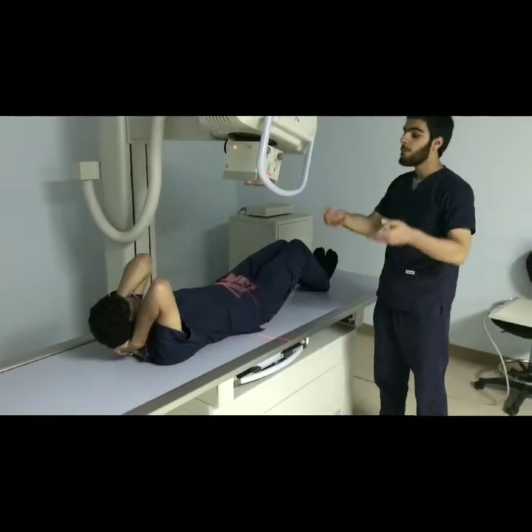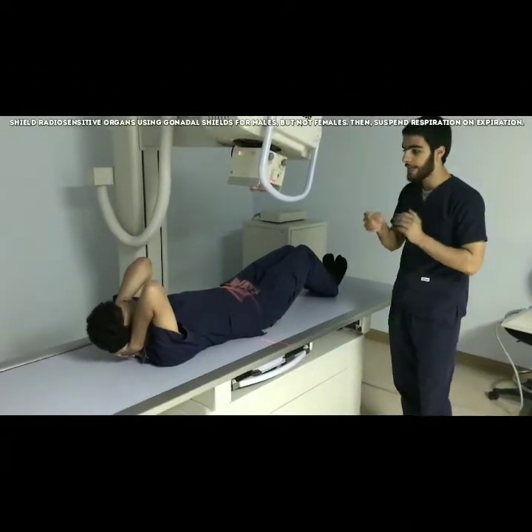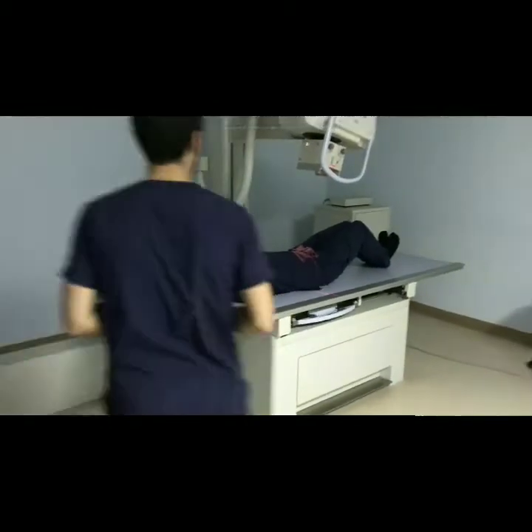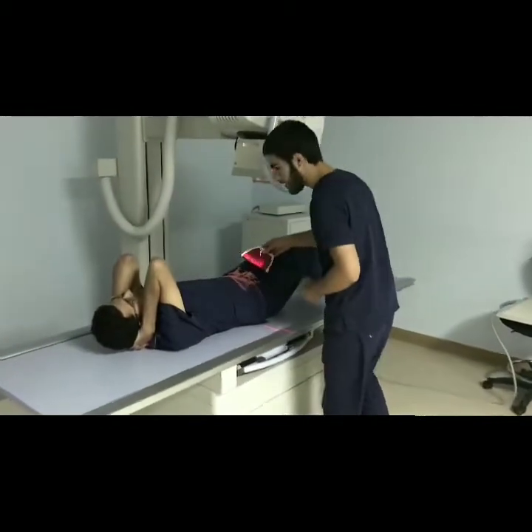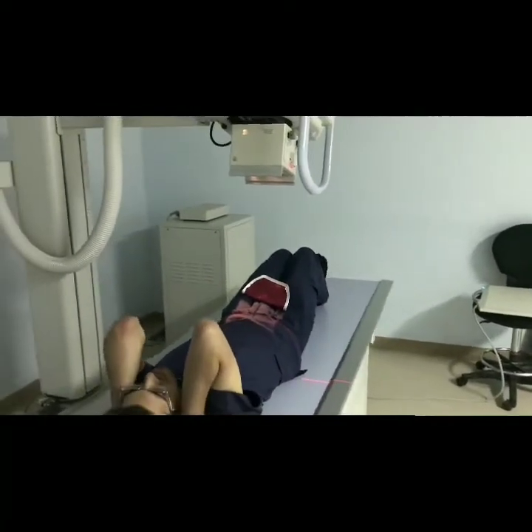Explain to the patient how he's supposed to breathe during the exposure. In this case the patient has to suspend respiration on the end of expiration. Place the gonadal shield for males and take the exposure.